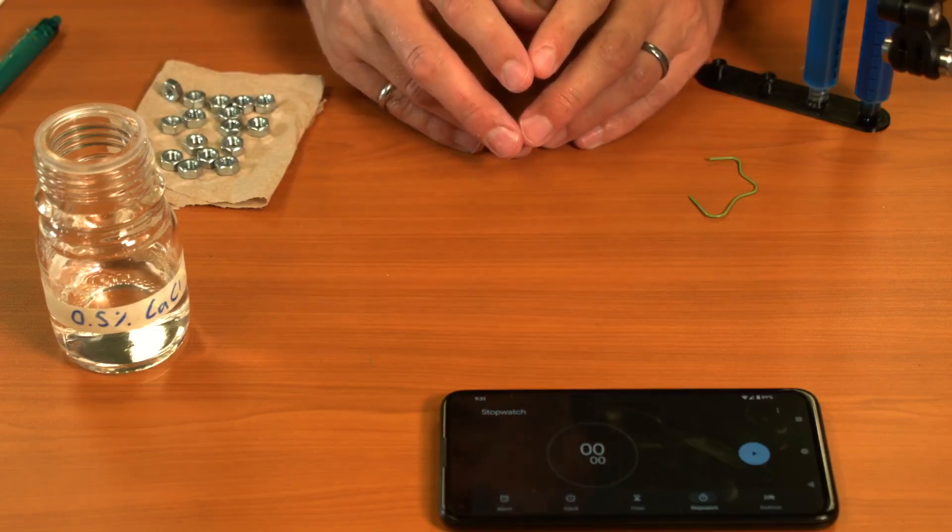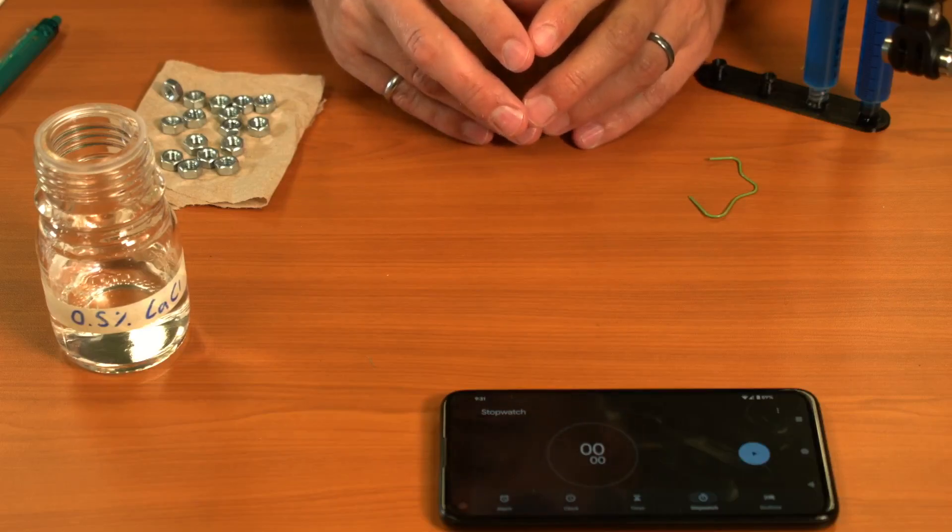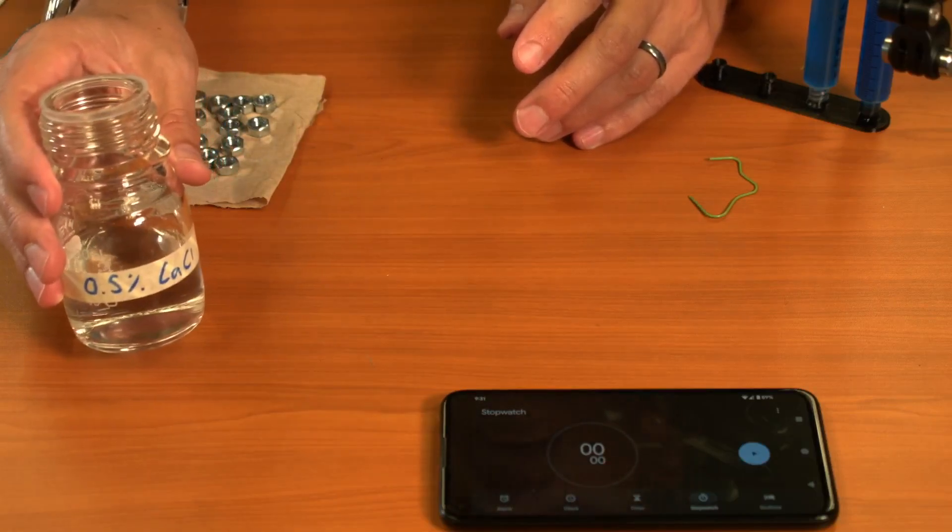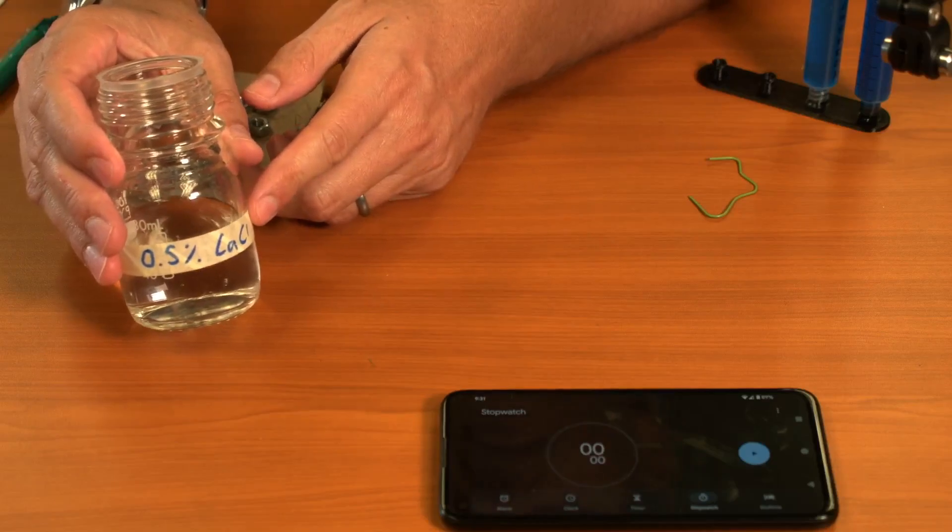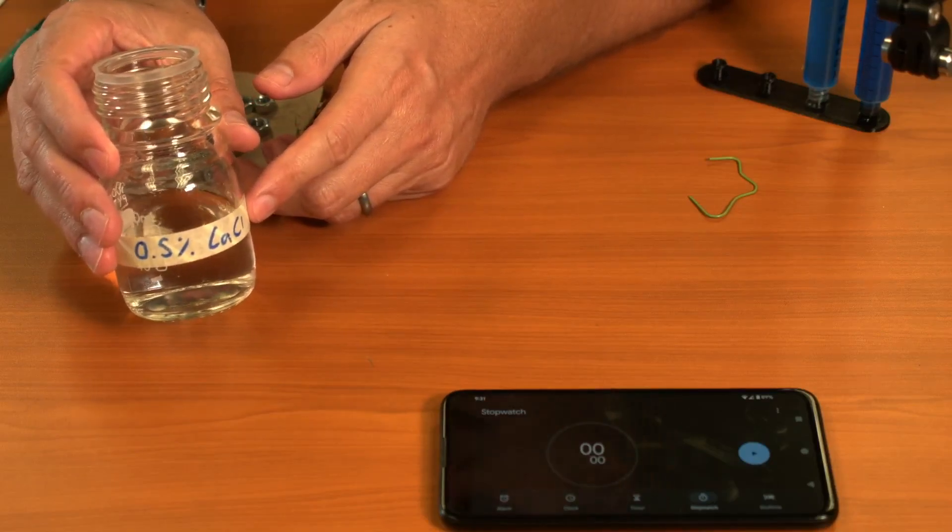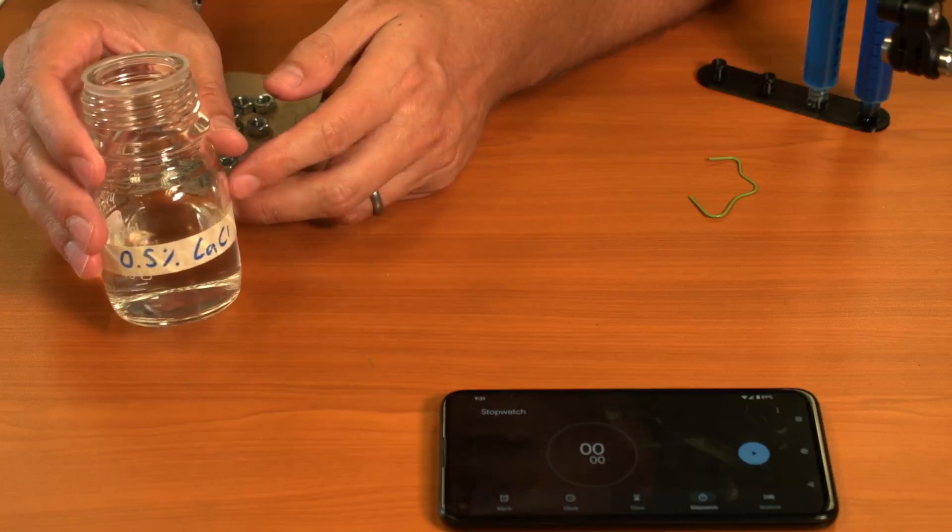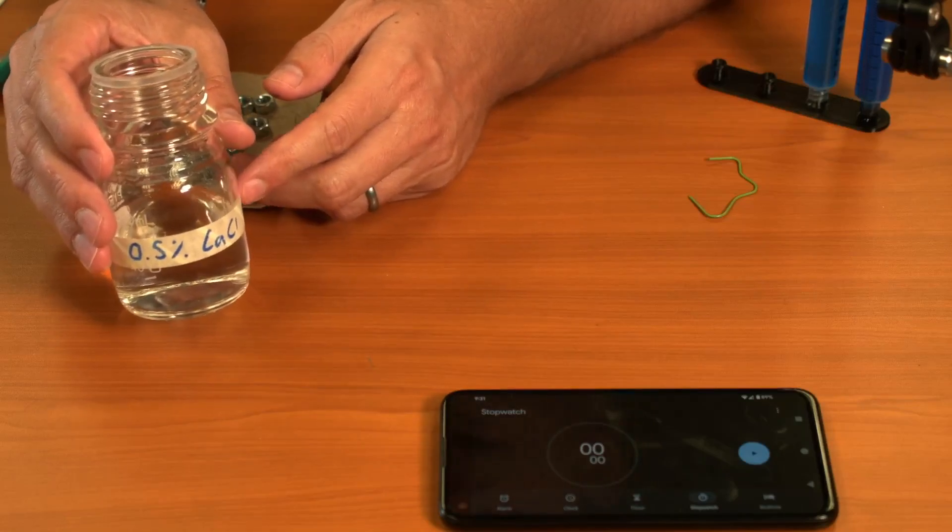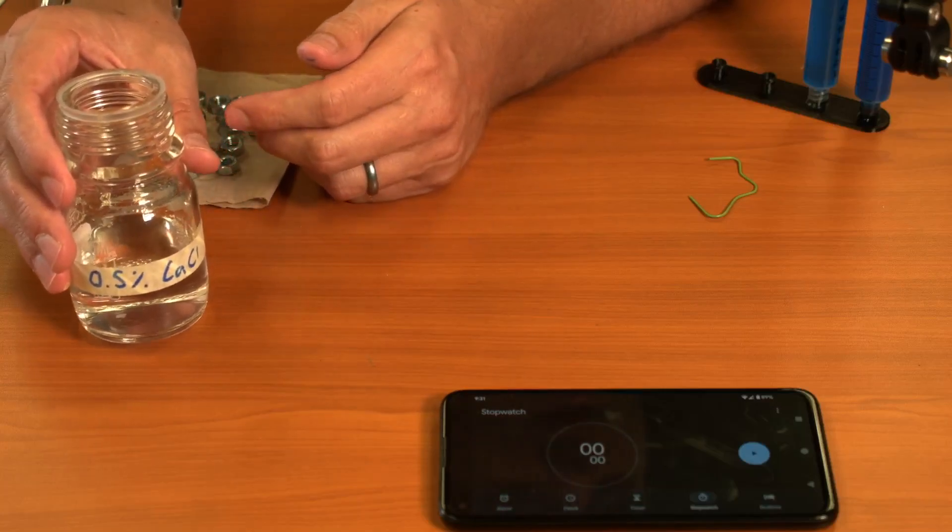Let's see what we need to get started here. We're going to need calcium chloride. This is a 0.5% solution, but anything from around 0.1% to 1 or 2% will work. The higher the percentage, the quicker this experiment should proceed.